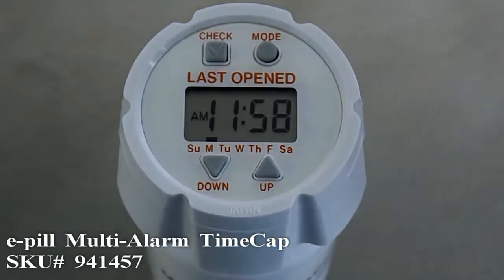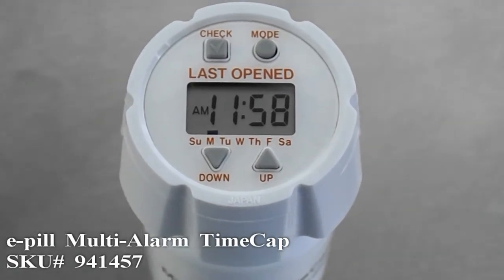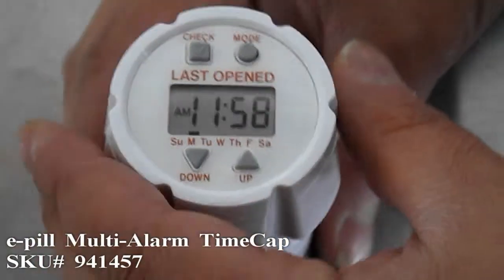This is the E-Pill Multi-Alarm Time Cap. We will show you how to set the time today. To set the time, first take off the cap from the bottle.